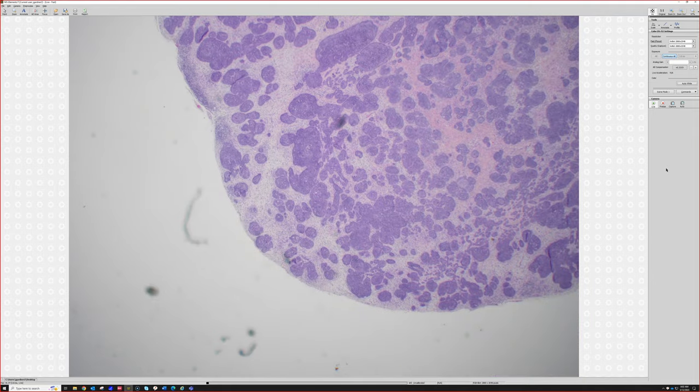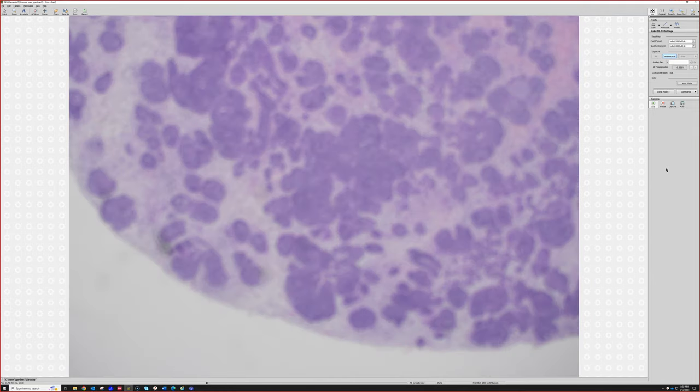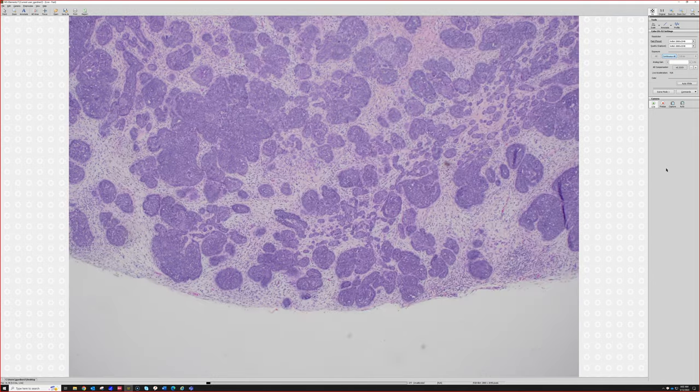But look at the stroma here. You can tell that the stroma around this is not normal dermis or subcutis. It is the stroma of this tumor, and it's got an edge, and the edge is right here. It had a plane of section between it and the surrounding tissue, and it popped and pulled right out like a marble when they went to excise it. I think they thought this was a cyst, because, you know, everything's a cyst until it's not.